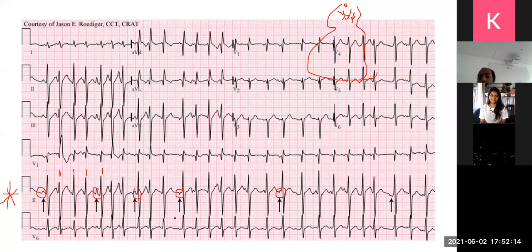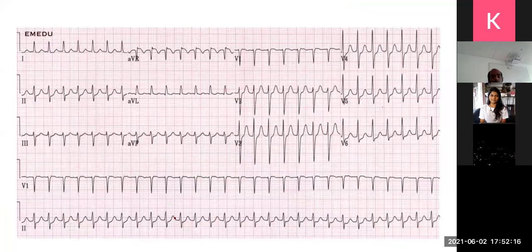Then look at this one, what is the rhythm? Look at lead 2. Look at lead 2. I'll give you 10 seconds to come up with the rhythm on this.